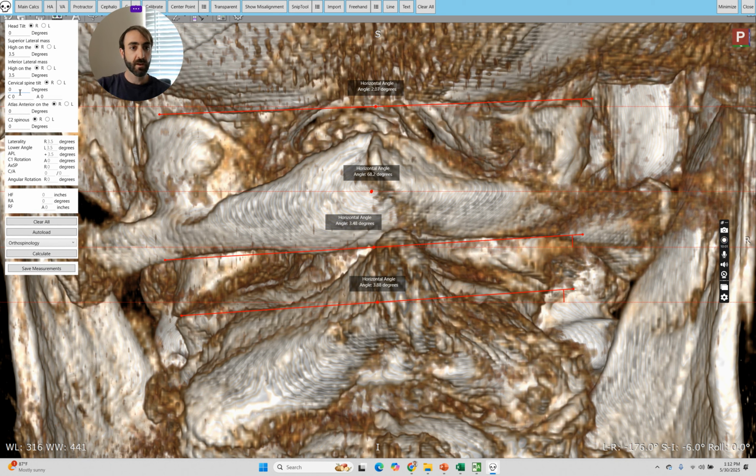And so that's kind of how Calculator works, is we're just going to fill out all of these boxes from top to bottom. And what the machine is going to do is it's going to say, well, if this is high, 3.5 degrees, and then later we're going to measure head tilt and see if that is tilted any direction, and they will put that in this box. And by comparing those against each other, we'll be able to determine a laterality, a lower angle, everything.